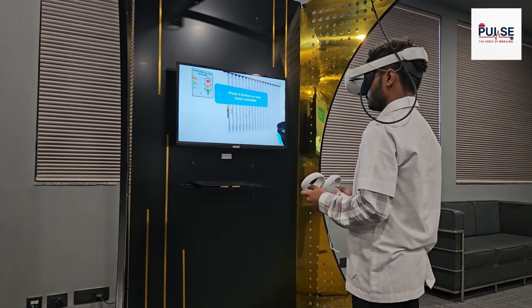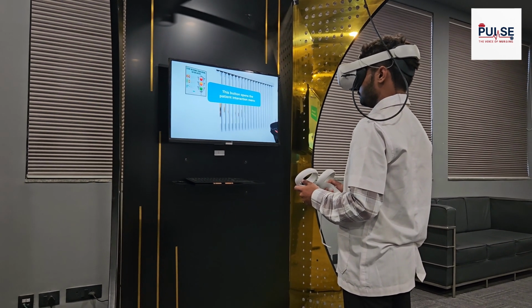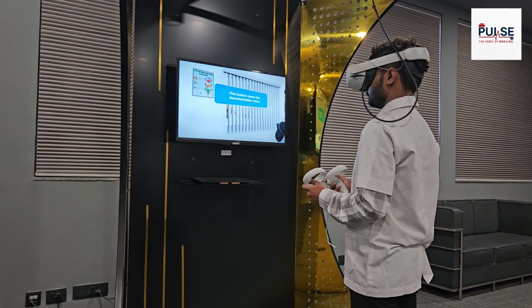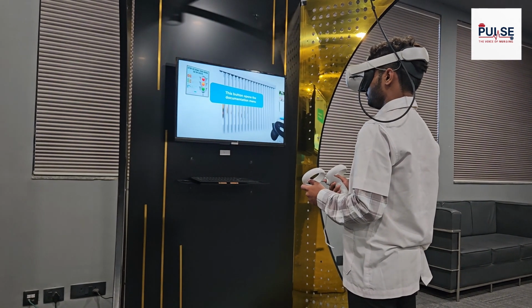Press a button on your hand controller. This button opens the patient interaction menu. Press the button on your hand. This button opens the documentation menu.